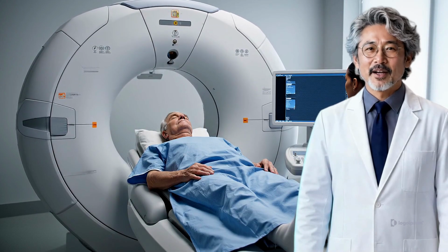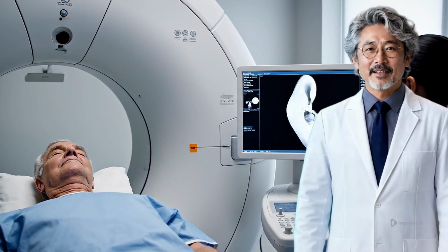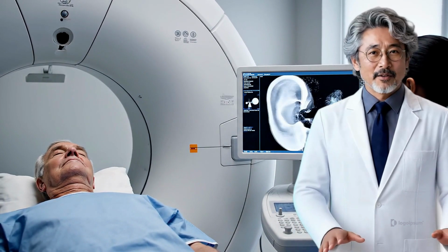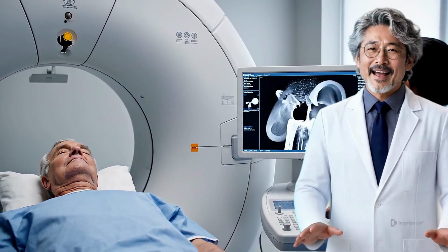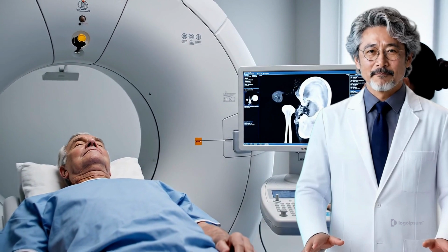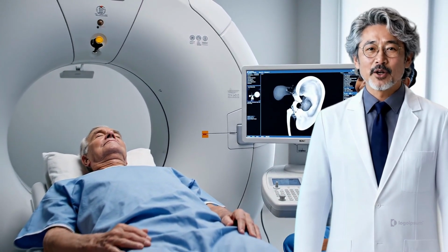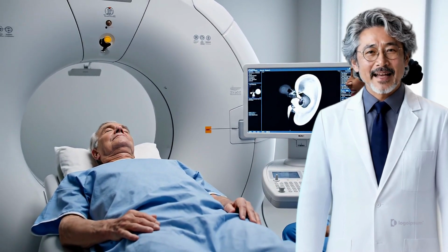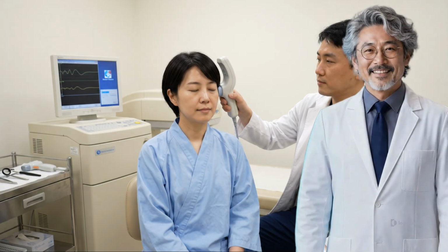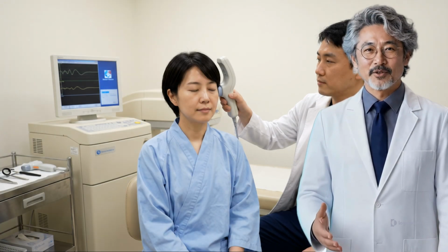For patients experiencing hearing loss, tinnitus, or chronic ear infections, a temporal bone CT provides an essential 3D roadmap. While an ear doctor can look at your eardrum with an otoscope, they cannot see the tiny hearing bones or inner ear chambers tucked deep inside your skull. This fast, non-invasive scan allows your specialist to check for fluid, bone damage, or structural causes of hearing loss to guide your treatment plan. The scan itself is completely painless and takes only about 5 seconds of actual scanning time.